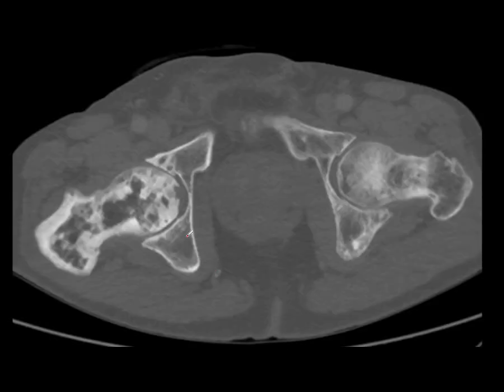Here is a CT scan showing thickening of the cortex and thickened trabeculae. This is something you really need to know quite well — Paget's disease — because you'll be seeing it frequently.